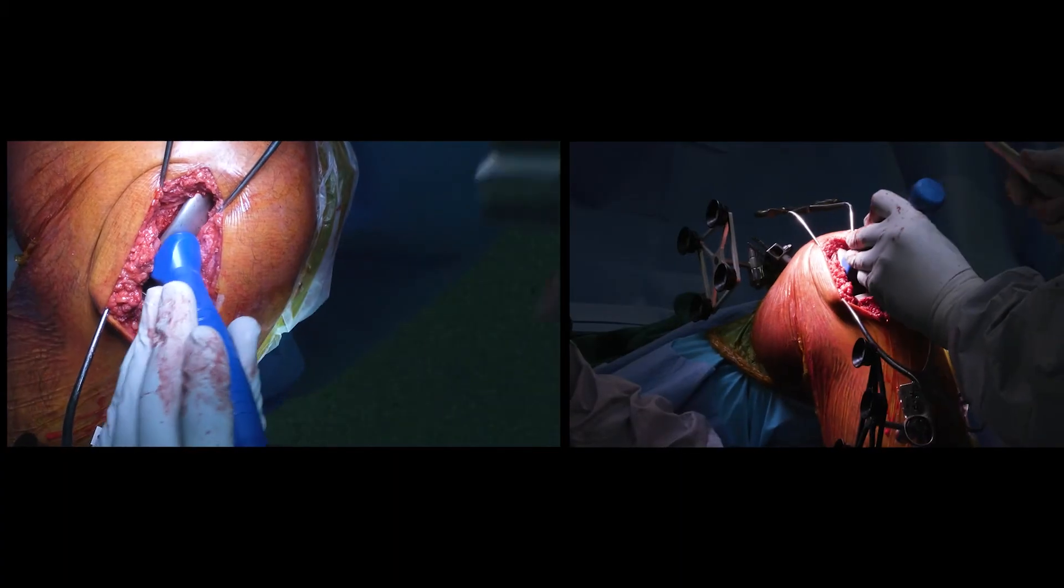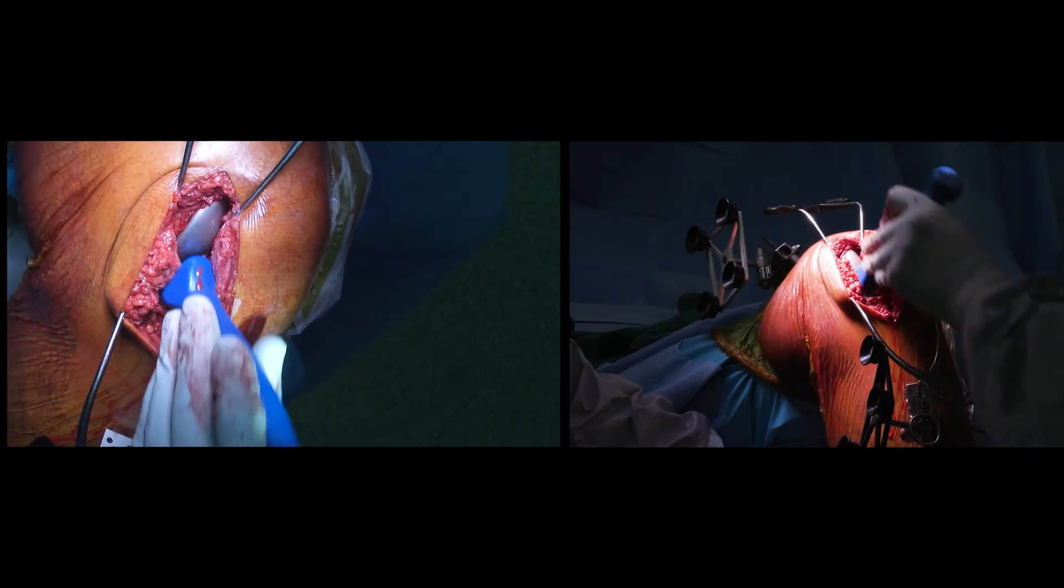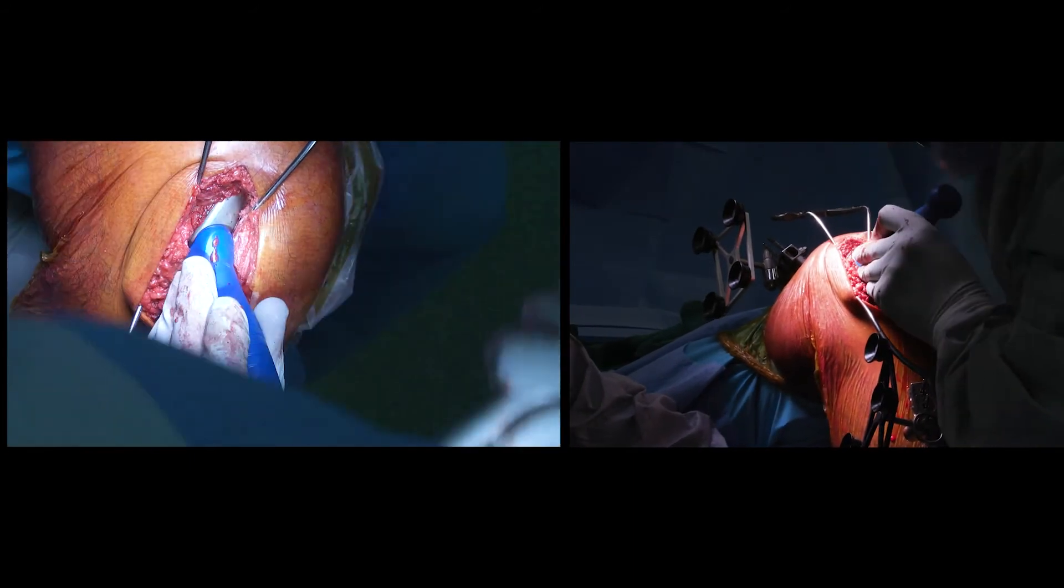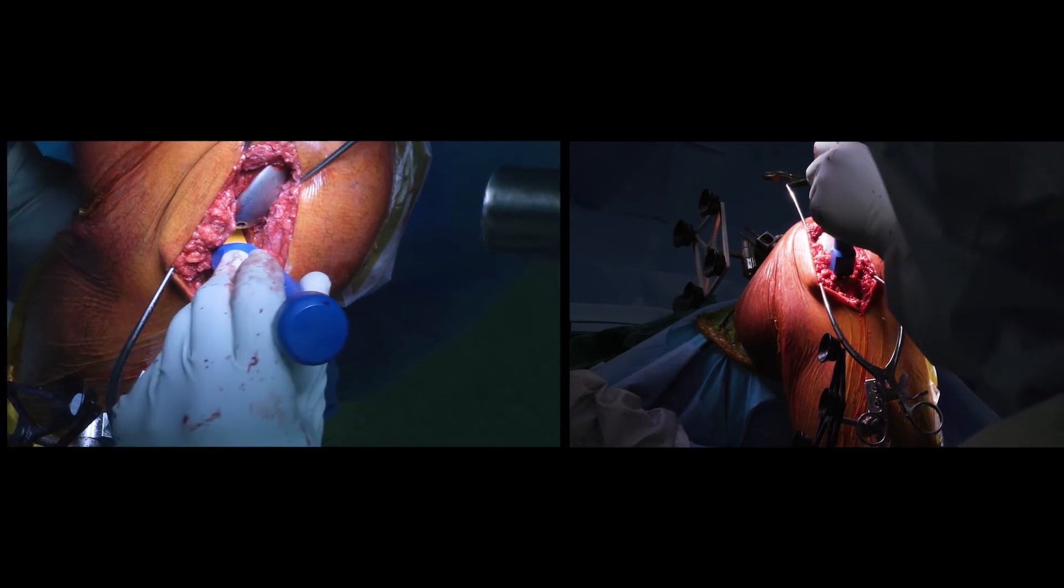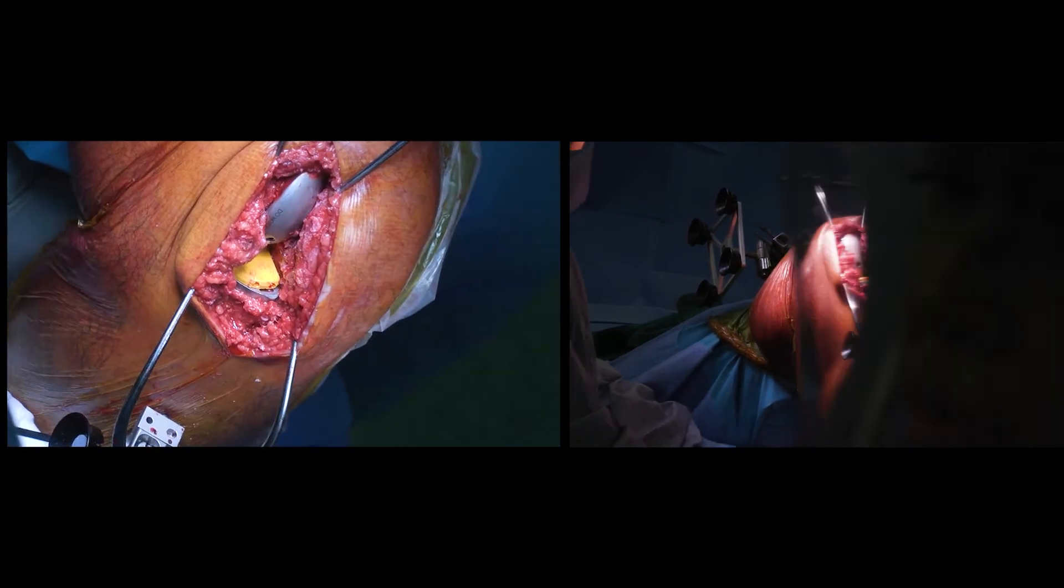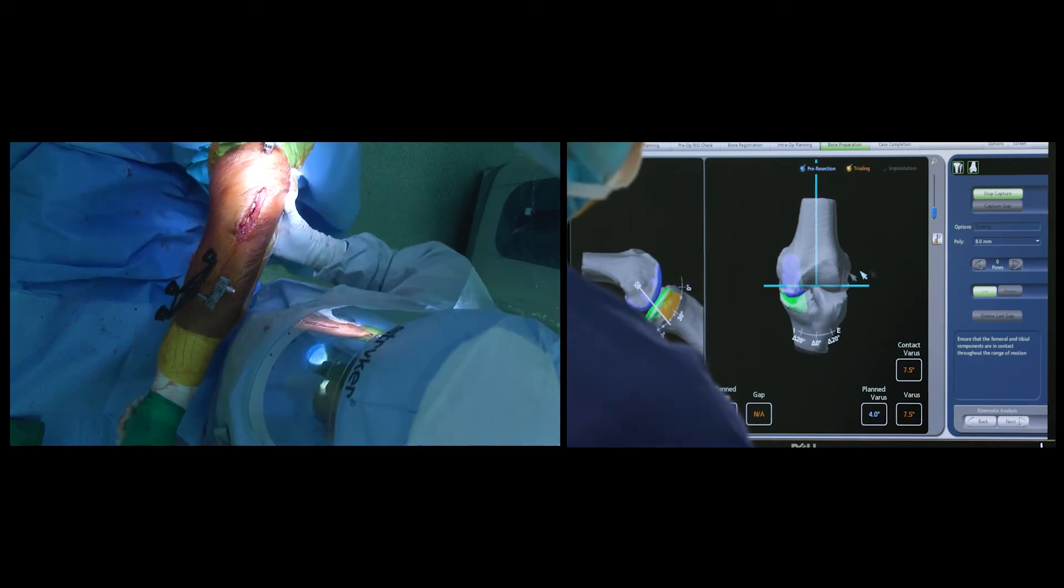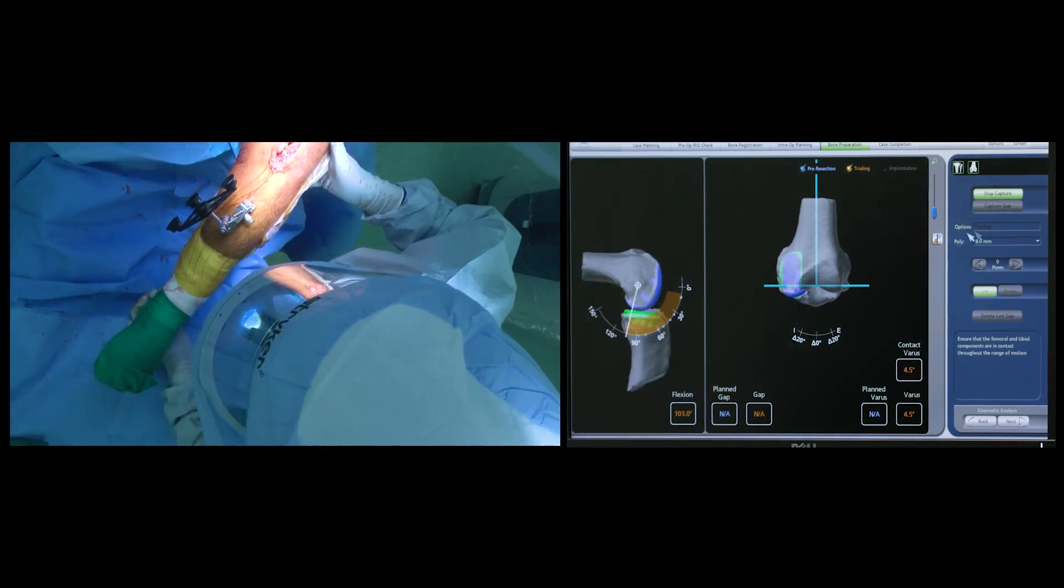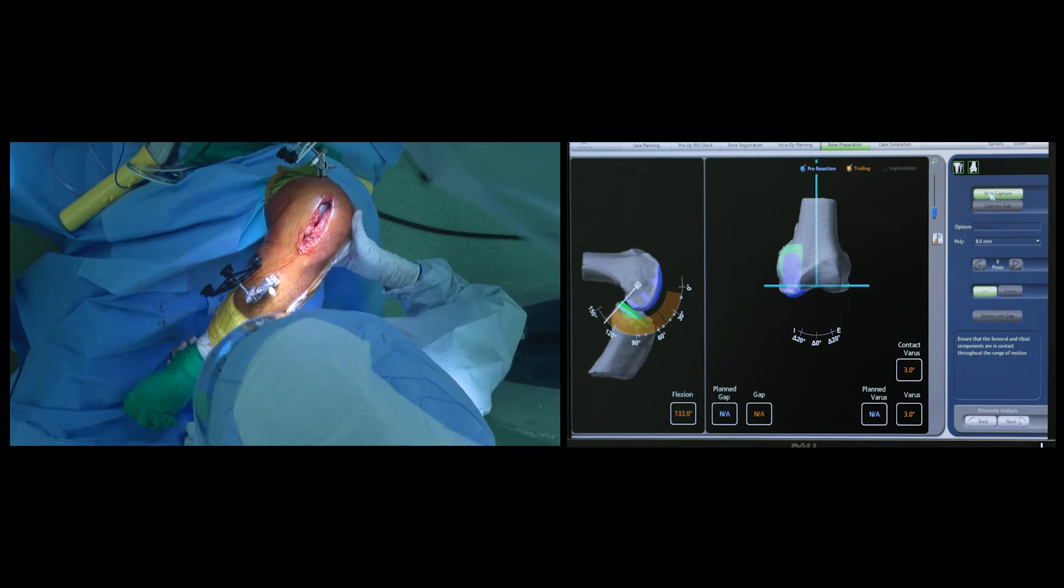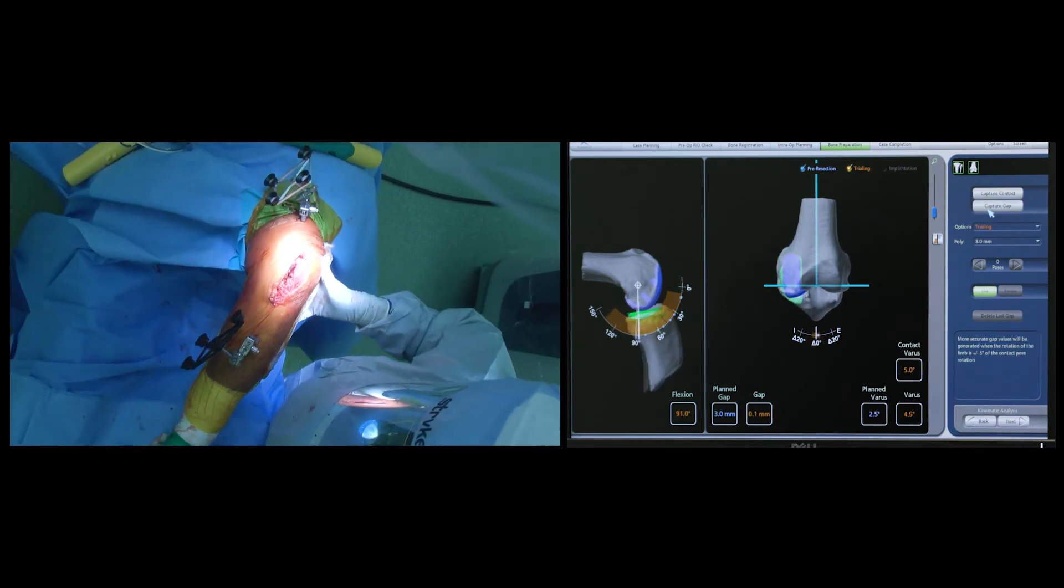Subsequent to this, the trial tibial and femoral components are impacted in place and the trial liner is inserted. At this stage, the knee is then taken through a range of motion and the computer can inform the surgeon of the final alignment of the knee and the range of motion that has been achieved.